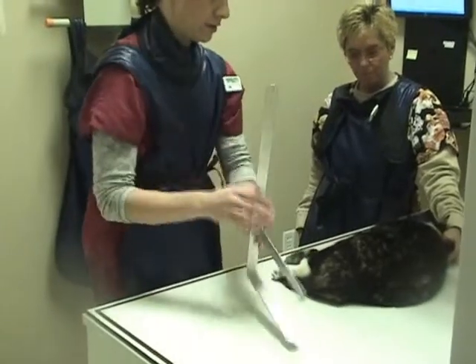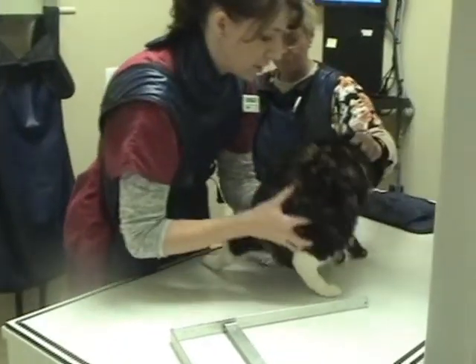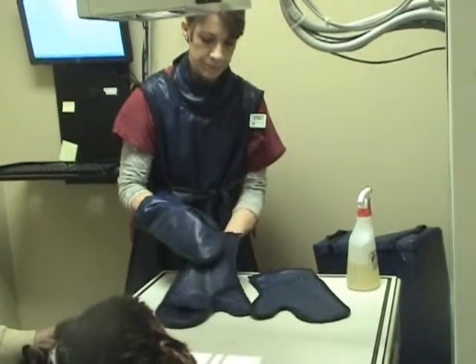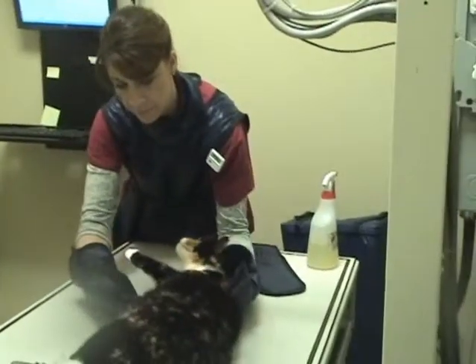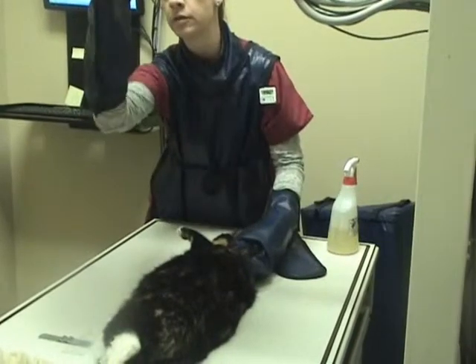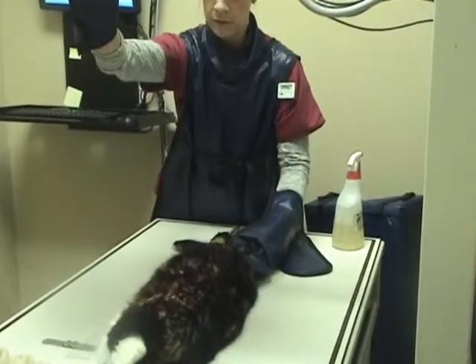Again, you would measure using calipers to get the size to determine your kVp. Remember Santes' rule of 2 times the caliper measurement plus 40, and then select the appropriate mAs for that kVp. At my clinic, we do use digital X-ray, so our settings are determined based on the animal's weight. When taking abdominal X-rays, place the caliper at the edge of the 13th rib.